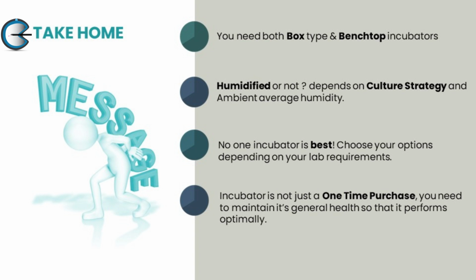The third point would be that there is no one incubator which is the best. So choose your options depending on your lab requirement, on your budget, on the ambient humidity and all other factors in your lab. And lastly, an incubator, just like marriage, is not just a one-time thing. You need to work on it to maintain its general health so that it performs optimally. So I hope that with this session you have gathered enough information to choose your next incubator.